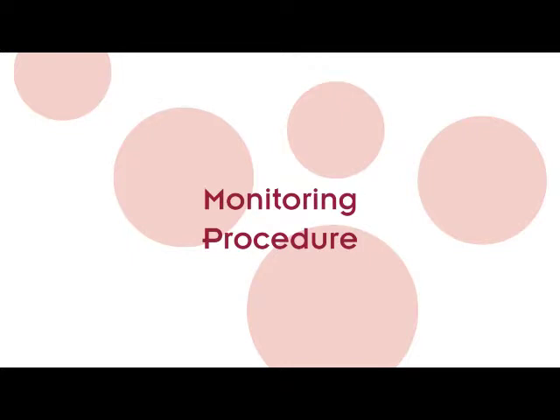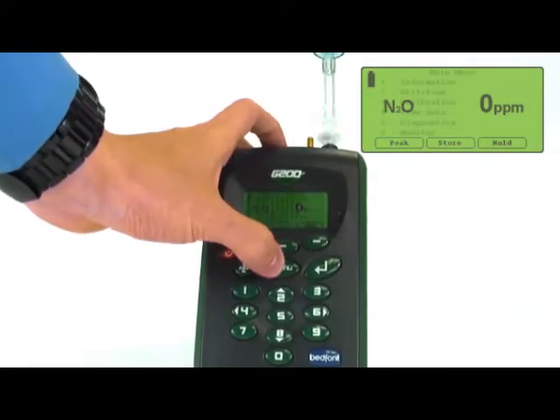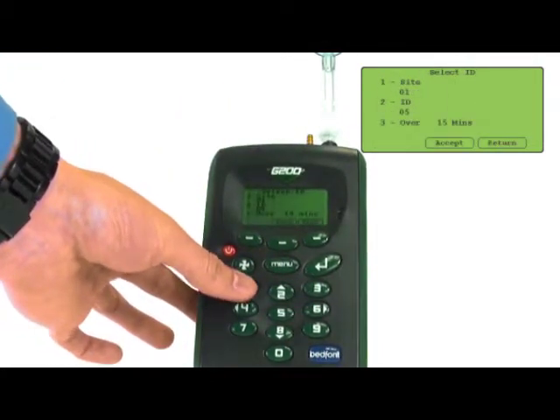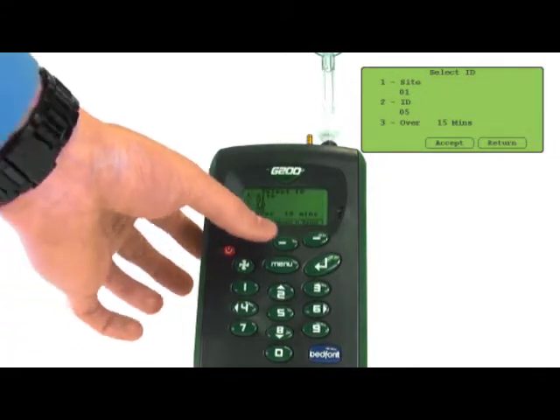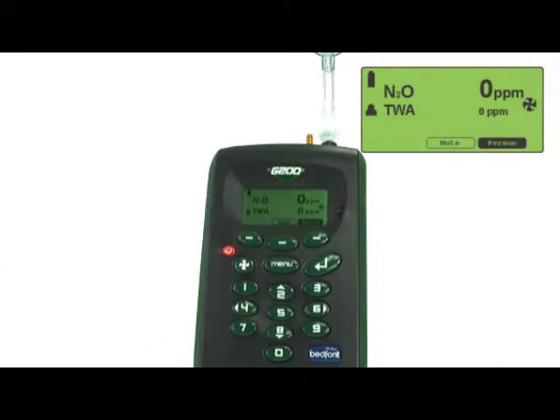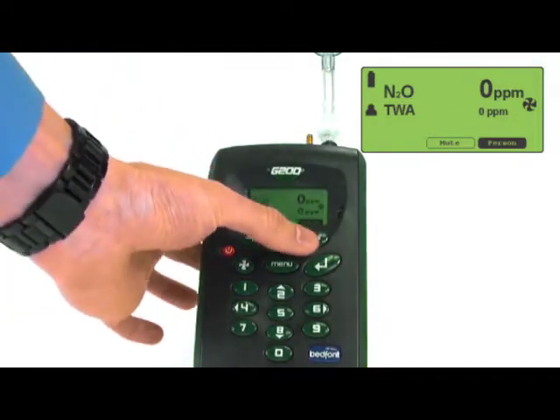Monitoring procedure. To begin monitoring in a specific mode, press the menu button and then select the monitor option. You will be prompted to set up a site if you haven't already. Once this has been done, you can press the accept button to continue. The G200 will begin to analyse N2O.